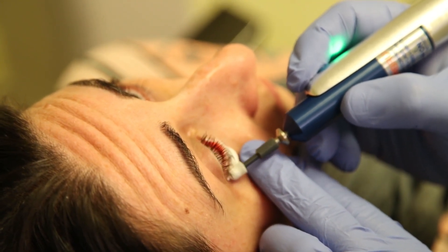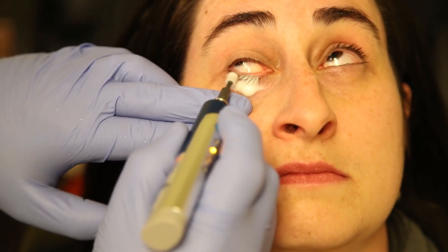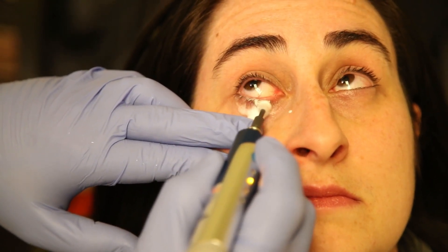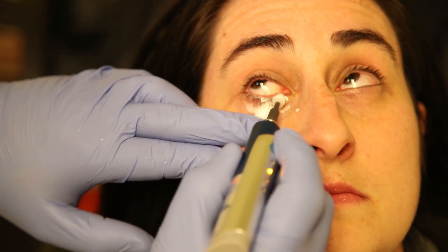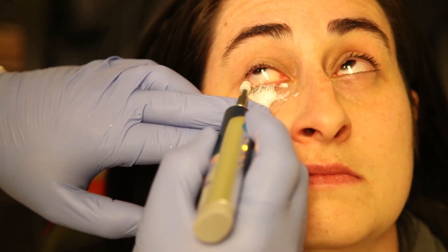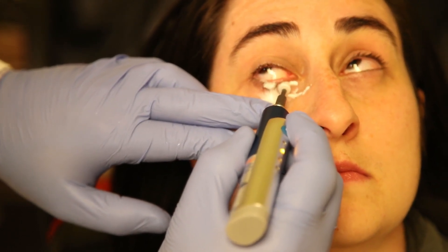This should take approximately 20 to 30 seconds. Next, press the power button again — this puts the AB Max into reverse mode and the yellow R light will illuminate. Repeat the process as before for another 20 to 30 seconds along the same outer lid margin. Reverse mode allows removal of debris that may have been missed in forward mode.